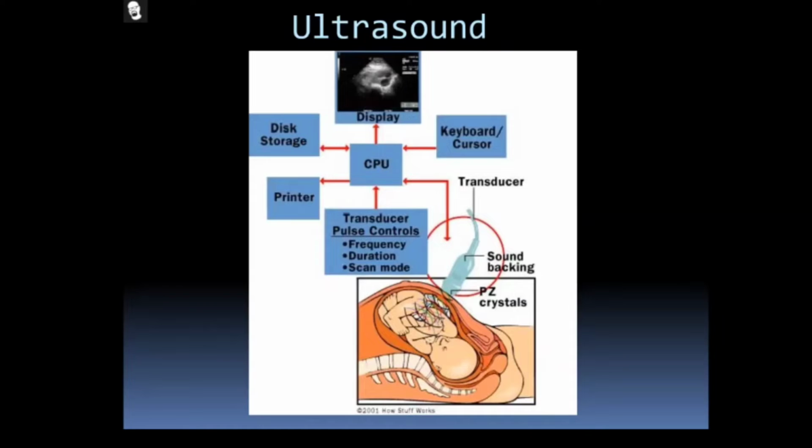According to the mode it will function, and the CPU is there; through the CPU, the functioning of all the keyboard keys we are using in that particular ultrasound will work. And on the screen we can find the drag box. Drag box means that we can divide the monitor into 6 patches.